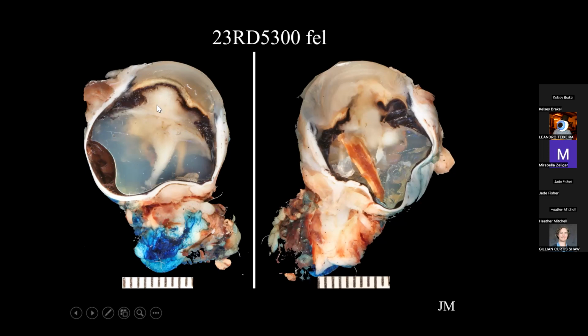And then when I took the cap off of the hemisection, at the top here, I sectioned right through a wooden foreign body in the eye. So that is what I'm going to show you in my squeaky chair. It was a big chunk of the wood.